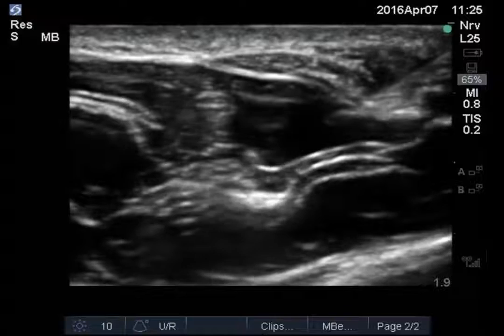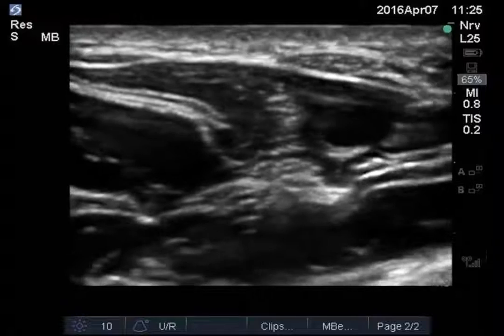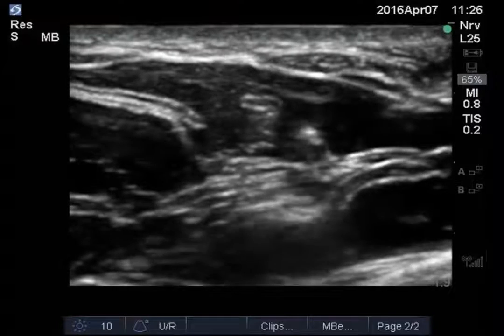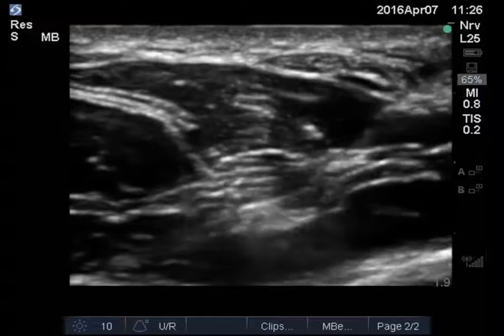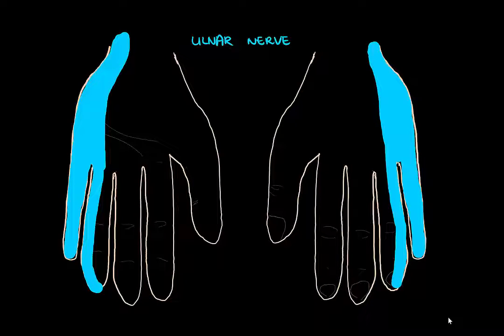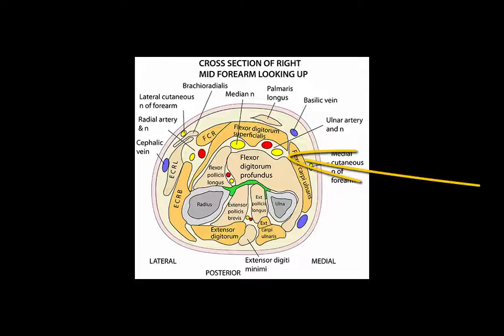Once you're done, wait just a few minutes and once again be amazed at how well that worked. Finally, if you'd like to block the ulnar nerve, the process is identical to blocking the radial nerve. Simply identify the ulnar artery at the level of the wrist, trace it proximally, and look for the ulnar nerve ulnar to the ulnar artery. Then perform the steps as for the other nerves.